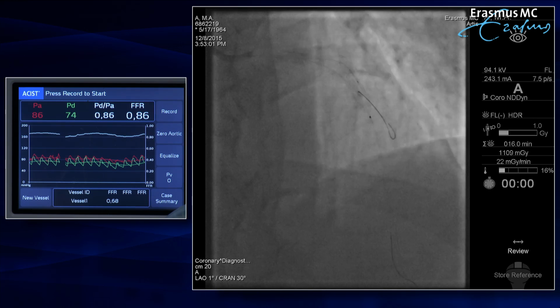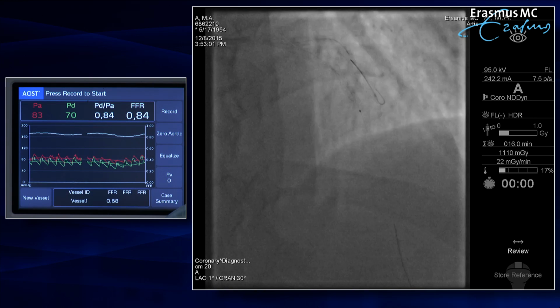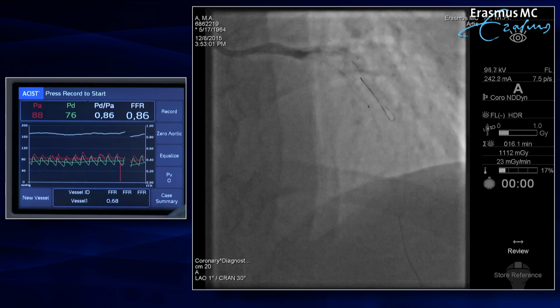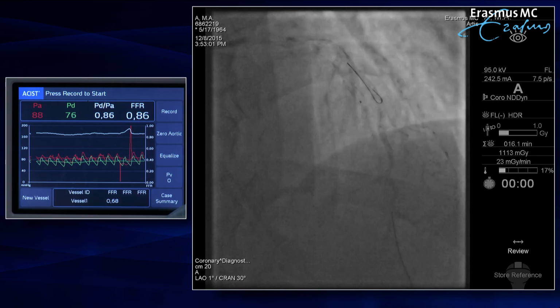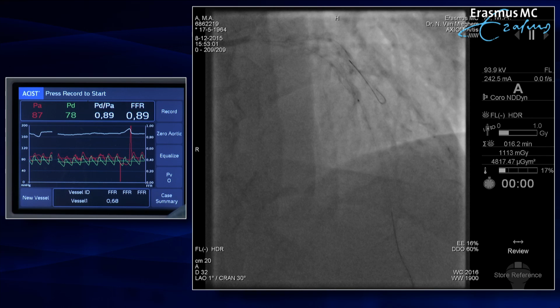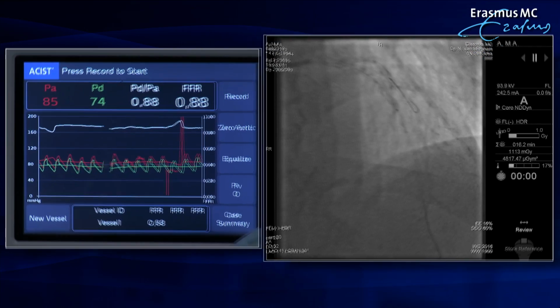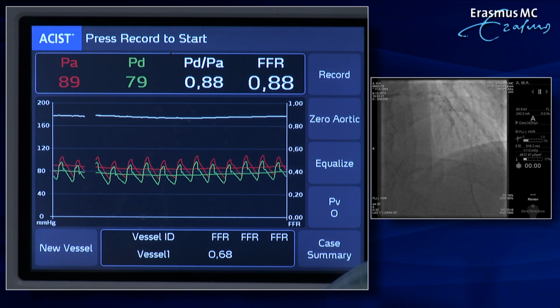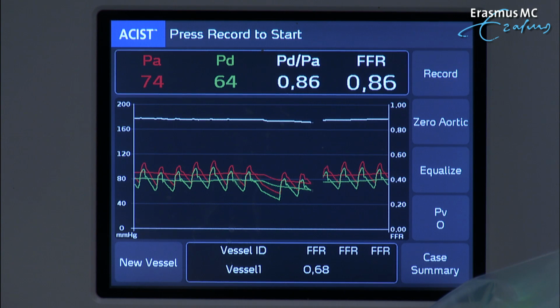So you are adjusting the... Yeah, I'm trying to get my guide properly aligned. Can you give me a little test now? Well, this looks pretty aligned. Okay, so can we start? The adenosine is already running. Okay, that's good. Let's wait. Let's give it another 30 seconds.